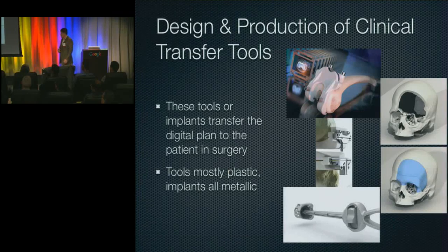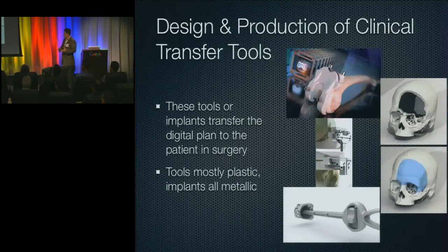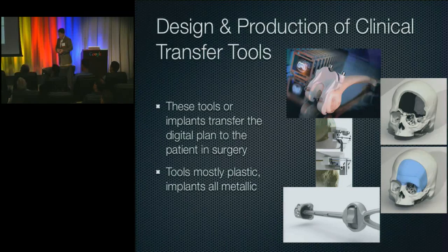But the next step, once you've planned out the surgery, and a lot of times we're involved in moving bone around. Bone's easier to simulate. There are a lot of reconstructive areas in the body that relate to moving bone around and fixing things from either trauma or congenital problems or joint replacement. And a lot of what we're focusing on today is joint replacement based, because it's where the market is. So things like knees. Once you've got a digital plan for creating cuts in a knee, for instance, you need to take that to the patient. So you'll use guides and jigs and different things to guide that.